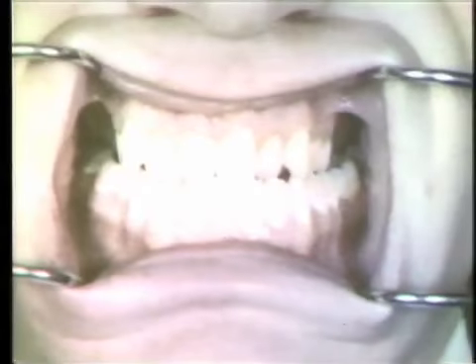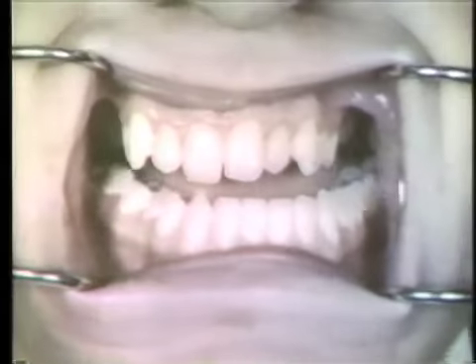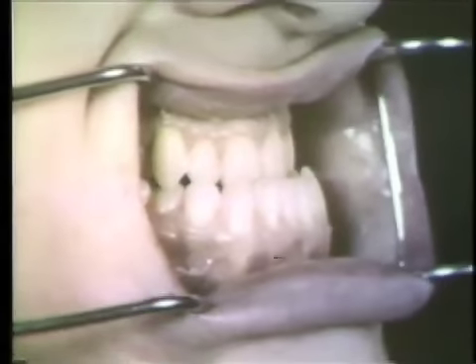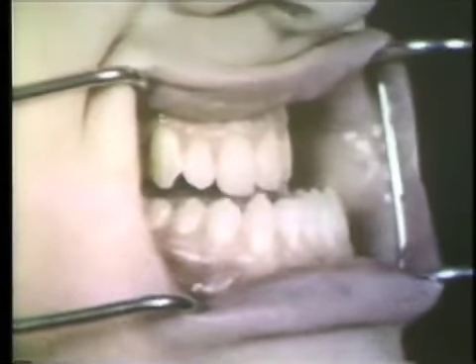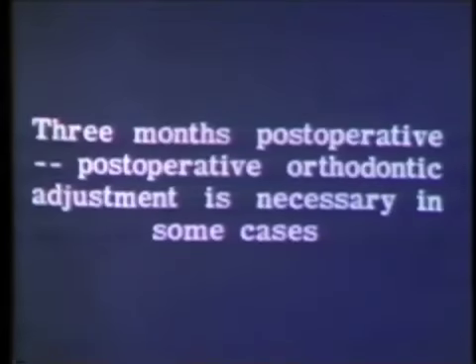Many of these situations are not ideal, and many of them reflect a disharmony that is more than a problem in the mandible. Many of them have associated maxillary deficiency as well as prominent mandibles. However, in this series, the attention is made primarily to the surgical correction through the mandible.